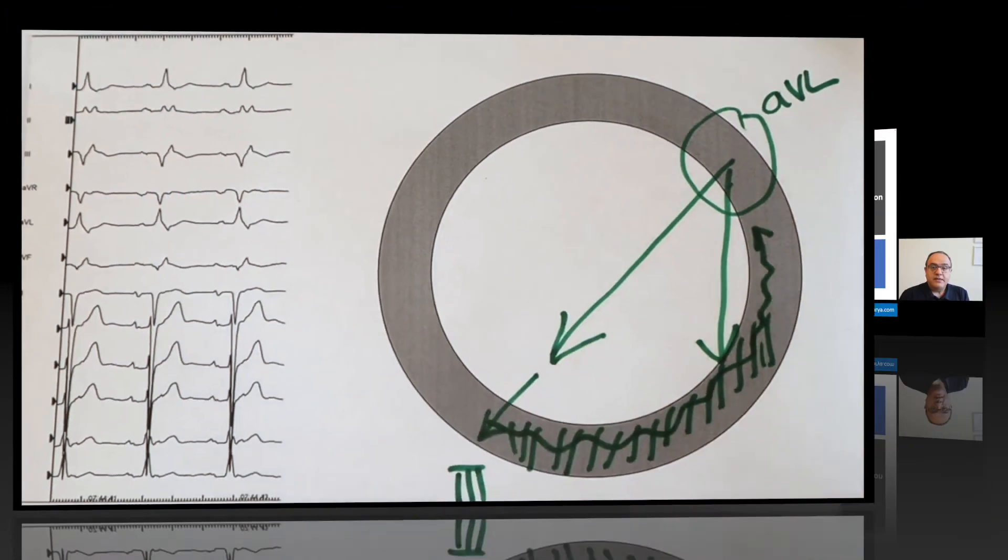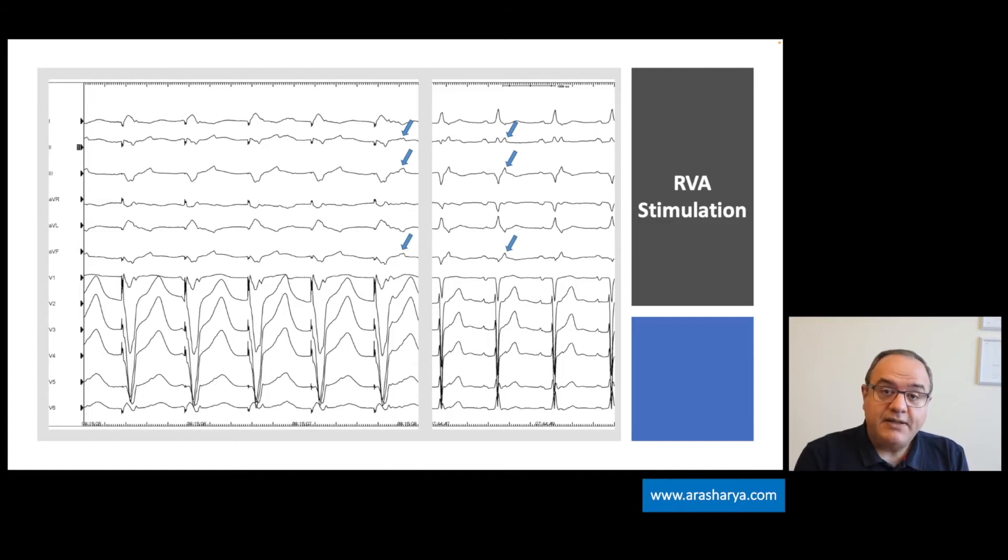Here we have the ECG on the left side during RVA stimulation, and you can see this delayed activity is more prominent. And actually, these deflections look like they happen way after termination of the QRS complex. Actually, it is just an apparent QRS complex, and this deflection is still part of the QRS complex, but because of very late activation after RVA stimulation, we can see the latest activation of basal inferior posterior superior part of the left ventricle.